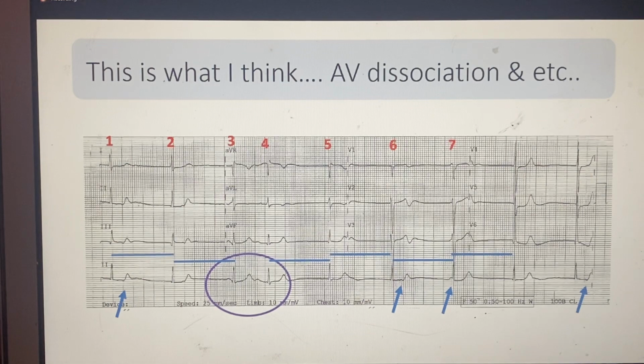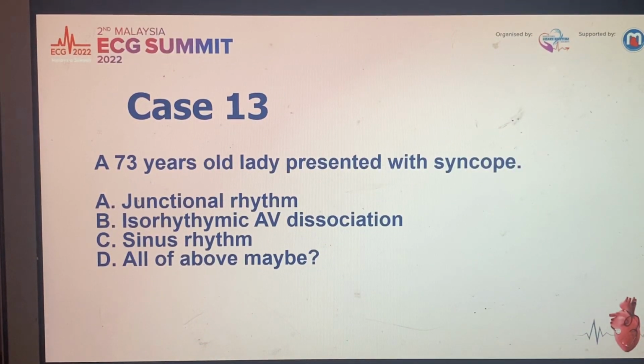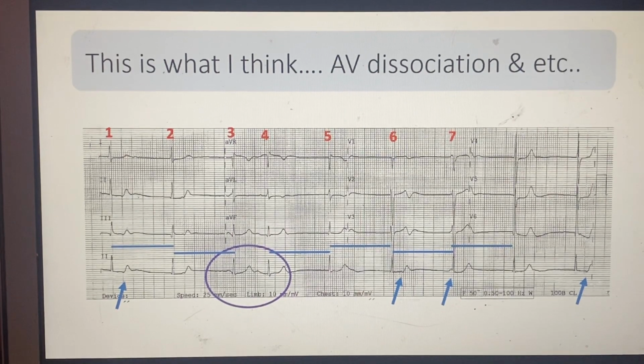I have a disclaimer here. I think none of us, me and Faiz, ever saw this ECG. Yeah, because I just kept this one as a surprise to everyone.